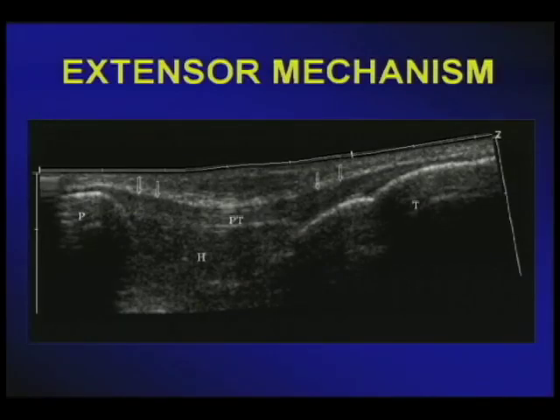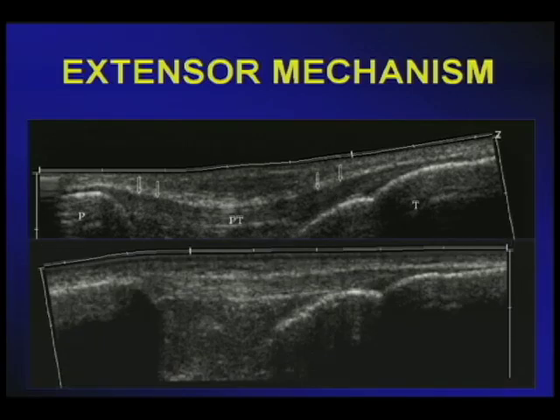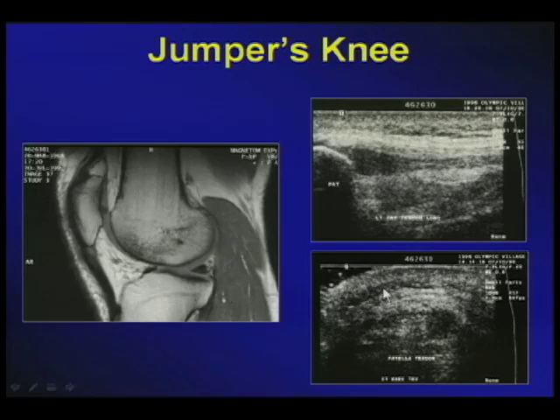If the knee is more extended than flexed, you will create some anisotropy of the patellar tendon. You'll appreciate that there is some hypoechogenicity in the infrapatellar portion of the tendon, and also as it inserts into the anterior tibial tuberosity. Simply have your patient flex his knee a little bit more, and in the same patient, as you can appreciate here, now we see throughout its entire extent the homogeneous fibrillar pattern of a normal patellar tendon.